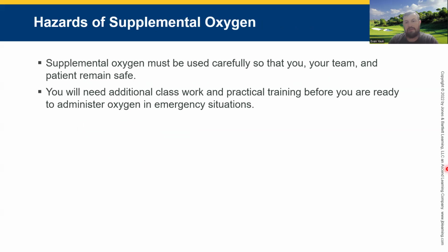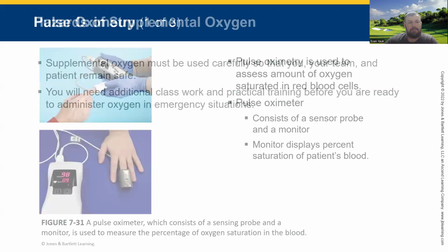Supplemental oxygen must be used carefully so that your team and your patient remain safe. You will need additional classwork and practice training before you're ready to administer oxygen in an emergency situation. I know that sounds crazy. Everybody's like, well, it's just oxygen, it's just air. It is a medication. You can over-oxygenate people.